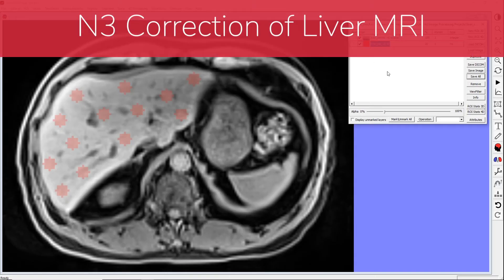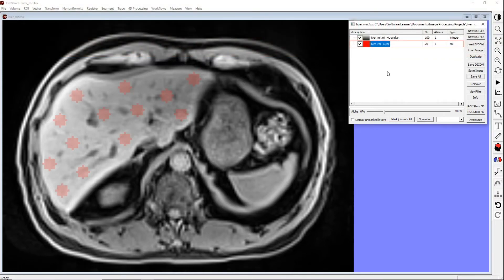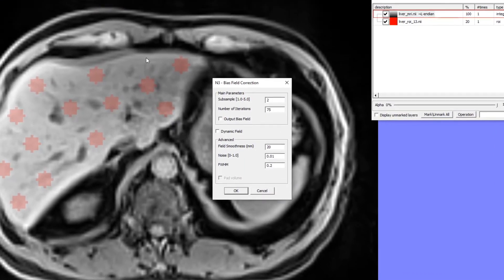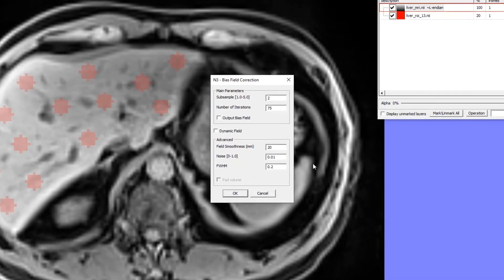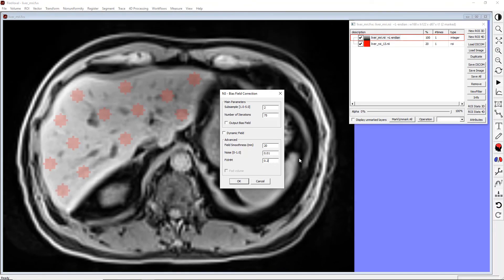Now let's go back to our liver image set. FireVoxel includes a simplified and accelerated version of the N3 method. We will use it to correct the liver images. On the Layer Control panel, select the base image. Next, use the main menu and select Non-Uniformity N3. This will open the N3 parameter panel. The key parameters here are the number of iterations, field smoothness in millimeters determined by the size of the B-spline grid, and the full width at half maximum of the filtering kernel. Set the number of iterations to 75, field smoothness to 20 millimeters, and full width at half maximum to 0.2. We will start by examining the bias field map. Check the Output Bias Field box and click OK.